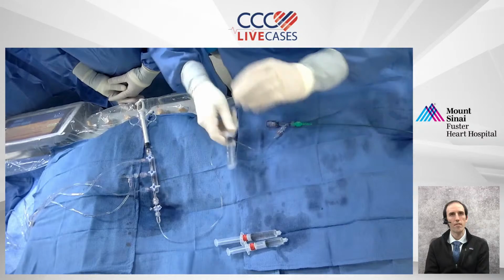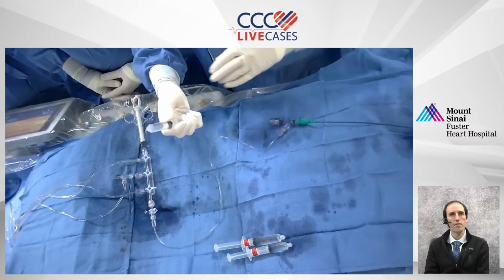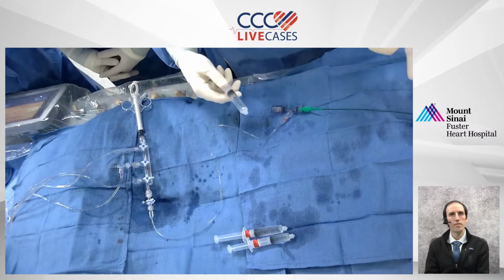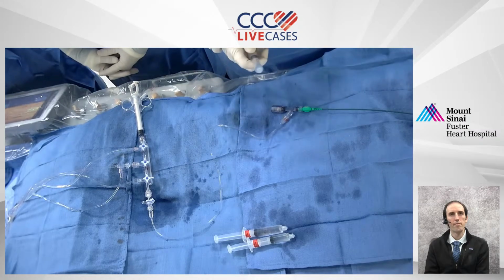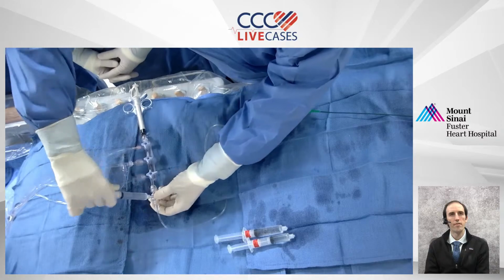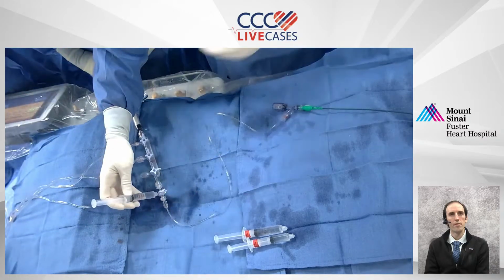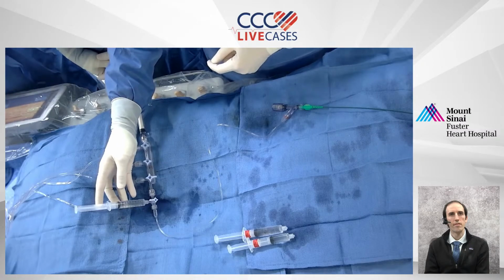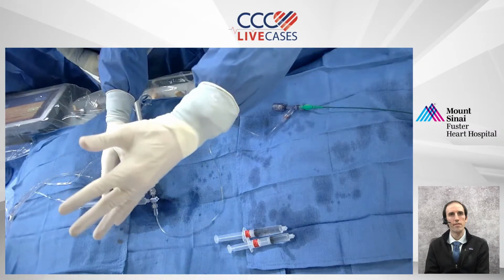And then what I do is I start a timer, and I know I'm going to have to displace at least 3 cc's into the guide or into the coronary. So what I do is I take a 10 cc saline flush, and I tell my team to start the timer. Get a baseline EKG, please. And I'm running a 12 lead EKG at the same time.